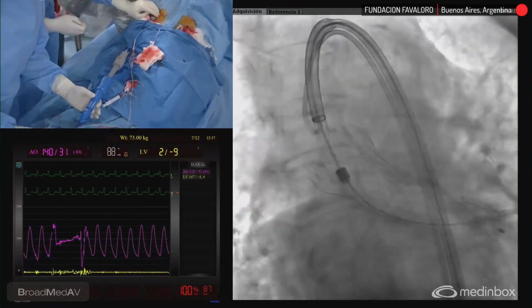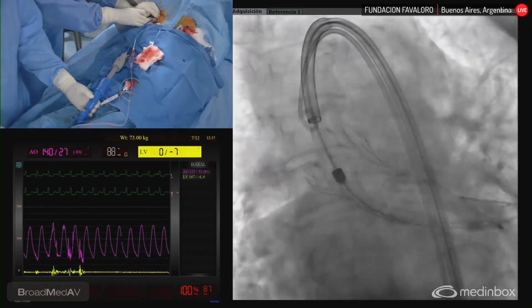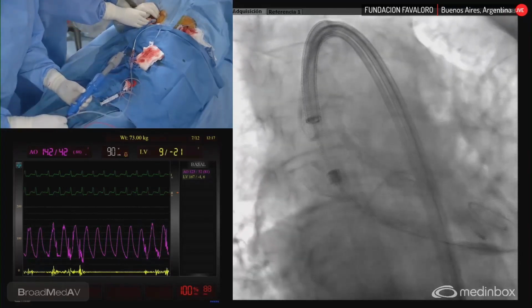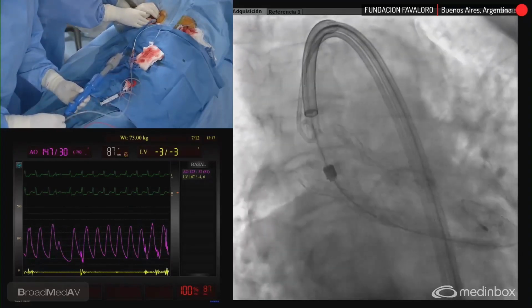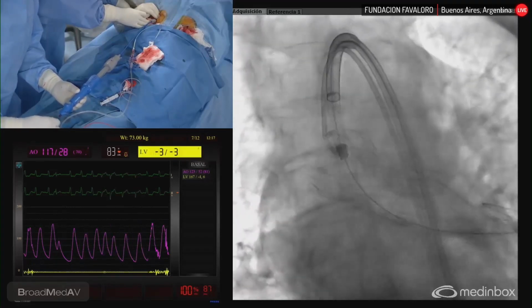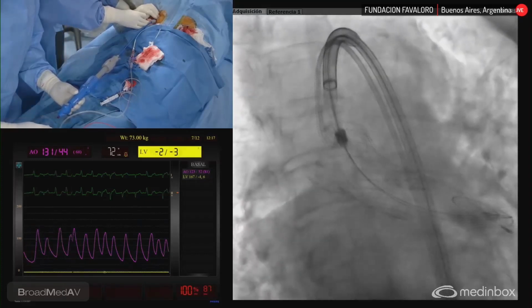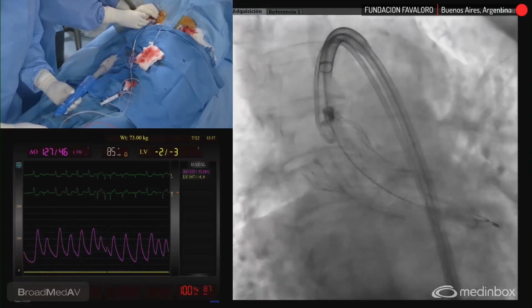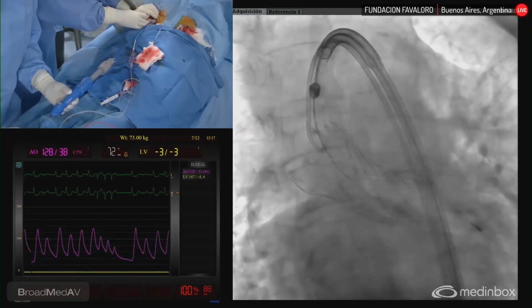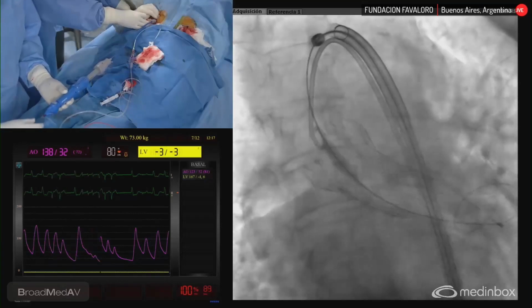So now is a critical step. I am absolutely convinced that both paddles are free. I'm going to pull. So the device is out. I had to centralize the nose cone as much as I can, using my loop. You see, it's working. And now I am out.